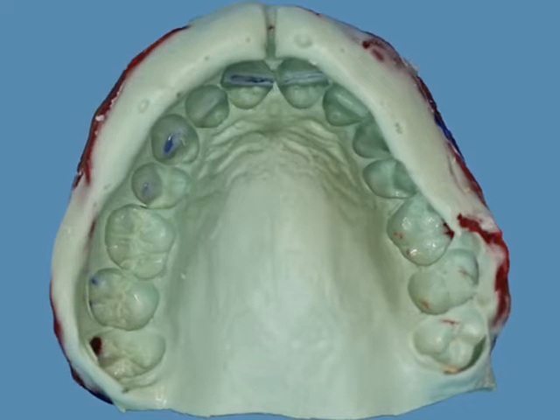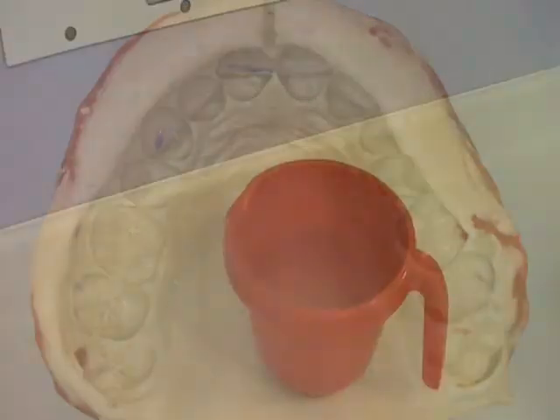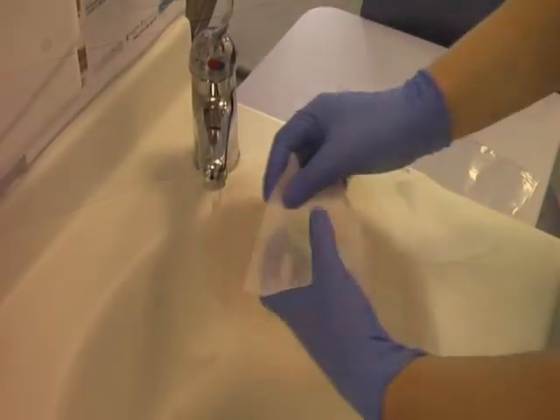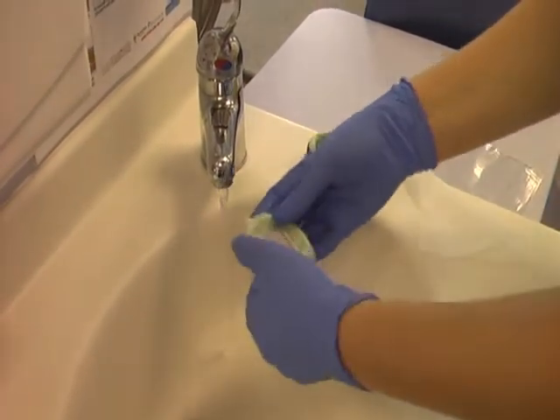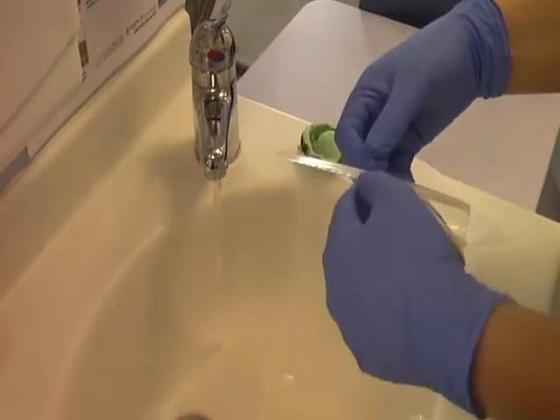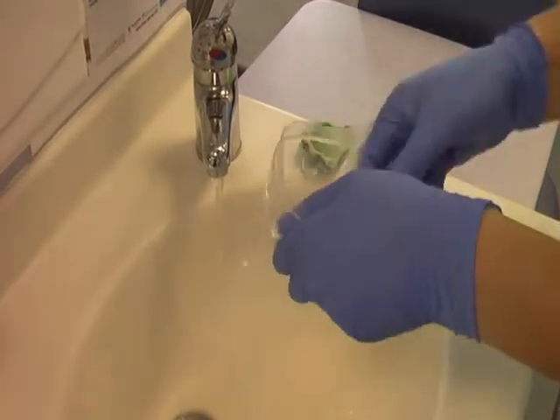Before sending your impression to the lab they must be cleaned and sterilised. Rinse them under water to remove saliva and then place them in hypochlorite for 10 minutes only, as alginate is dimensionally unstable. Wrap your finished impression in damp gauze, pop it in a plastic resealable bag. Your impression is now ready for storage prior to sending to the lab.